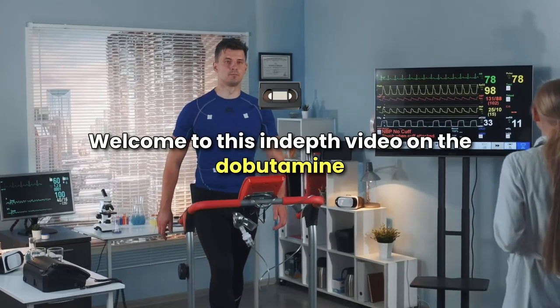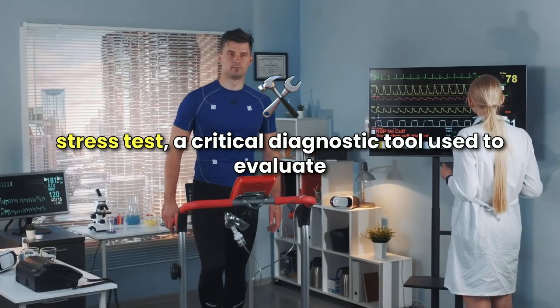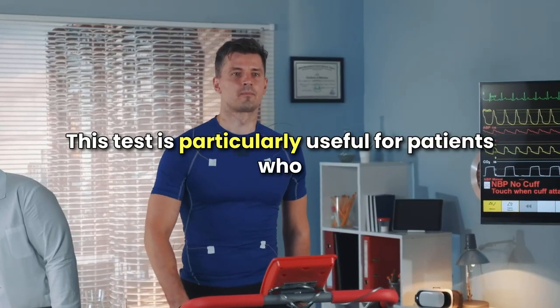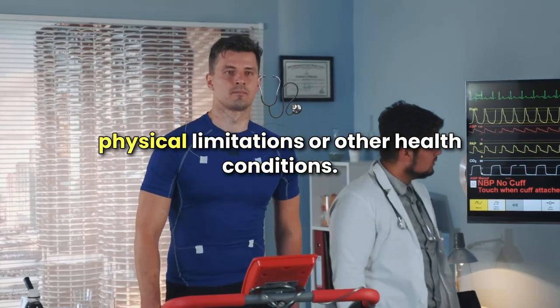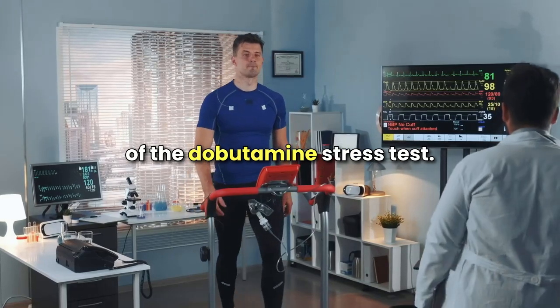Welcome to this in-depth video on the Dobutamine stress test, a critical diagnostic tool used to evaluate heart function and detect coronary artery disease, CAD. This test is particularly useful for patients who cannot undergo traditional exercise stress testing due to physical limitations or other health conditions. Let's start with an overview of the Dobutamine stress test.